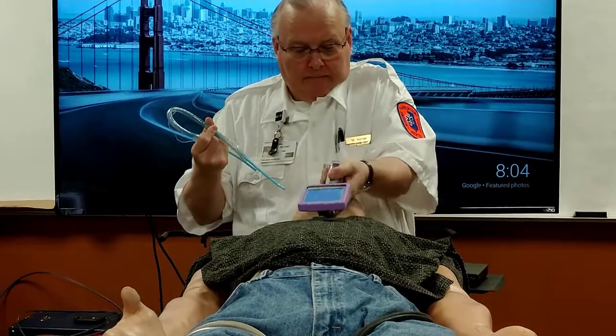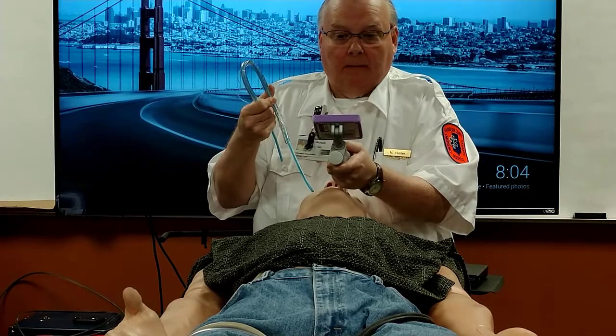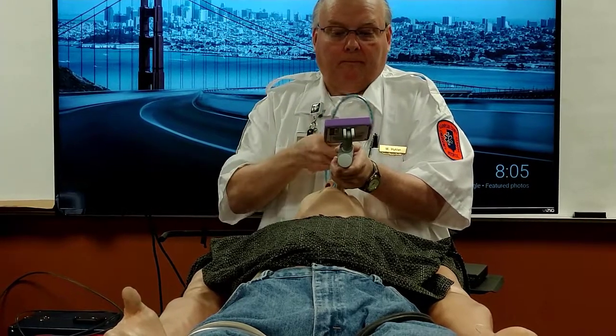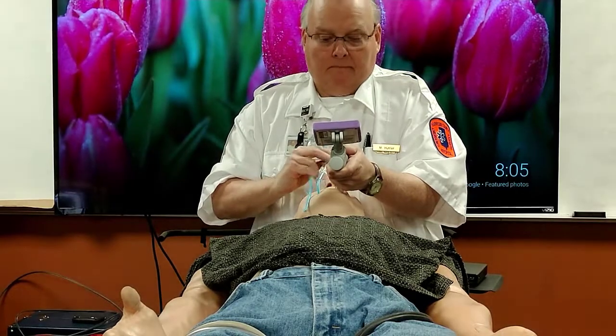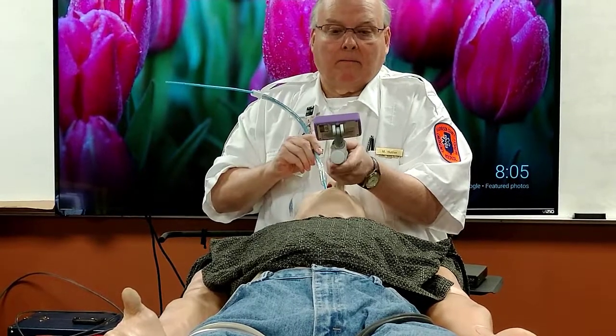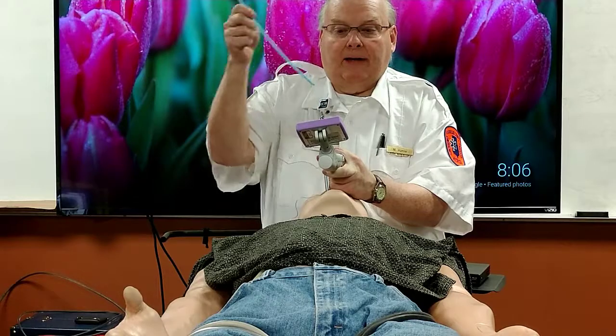I'm going to introduce the blade, and I'm going to look for my landmarks. I'm going to introduce the bougie. Introduce the bougie, slide the tube down, pull the bougie out.